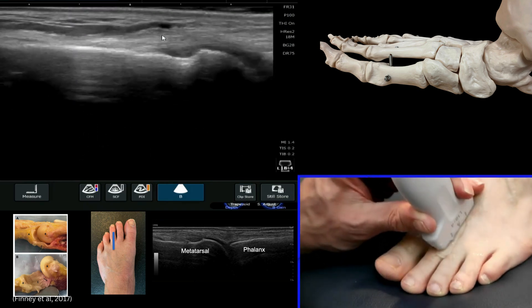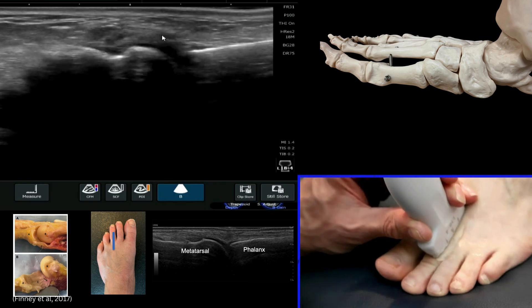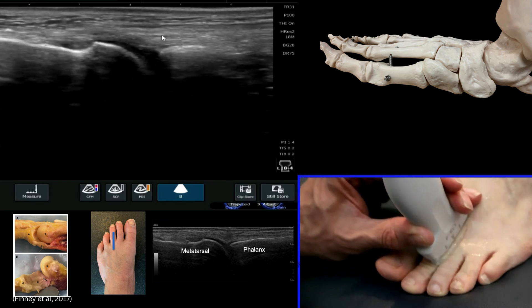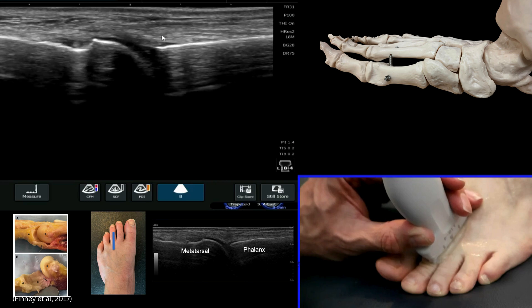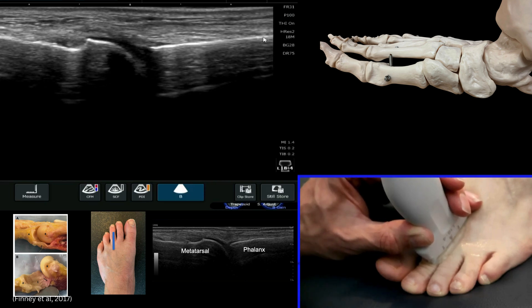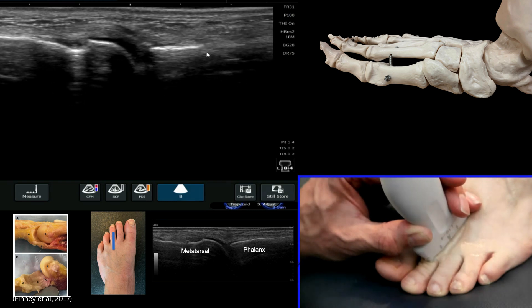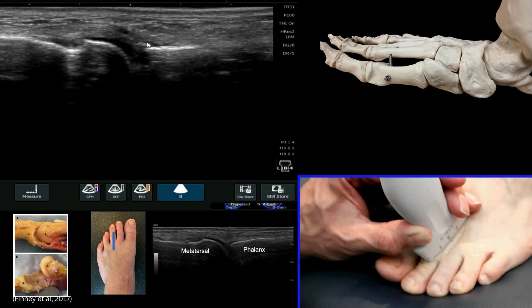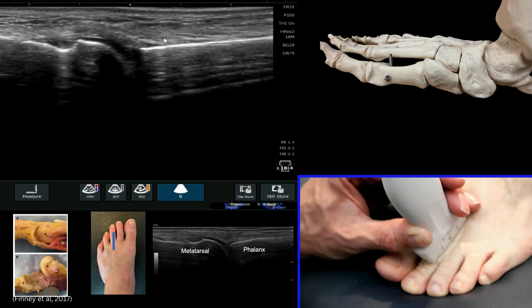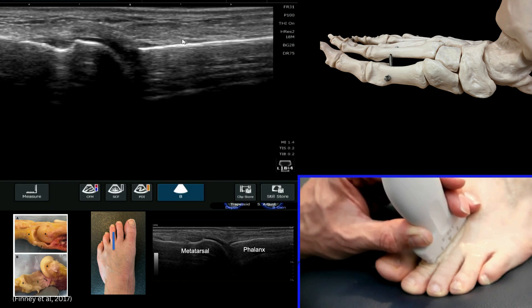If we then move our probe across slightly, we can also have a look at the second. Important here are these views to try and ensure that you're not oblique to the joint. You can see here that my cortex of the proximal phalanx is consistent — I'm not oblique to it. Seeing just part of it here means that I'm probably oblique to the joint to some extent. Ensure that you're fishtailing your probe round to see this cortex nice and clearly.